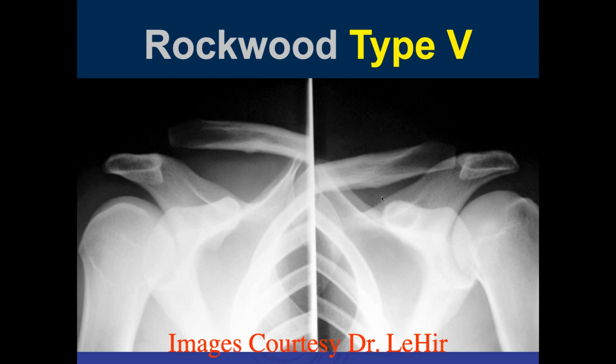I thought that 5 is the acromion is above the clavicle. No. I don't think so, John. Okay, I've been wrong before, John. Yeah, that's a type 6. We went to only 5, and I guess they added a new one.